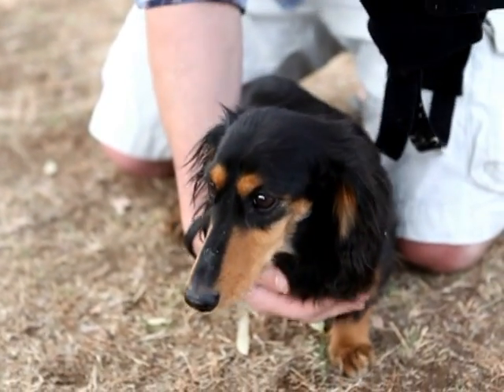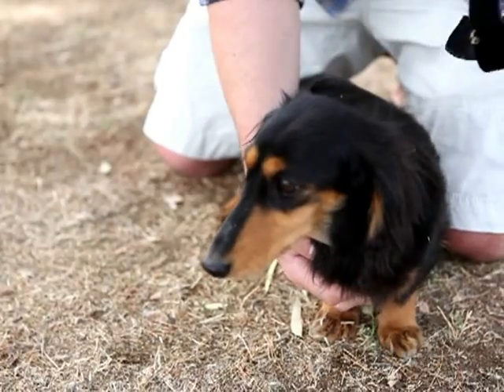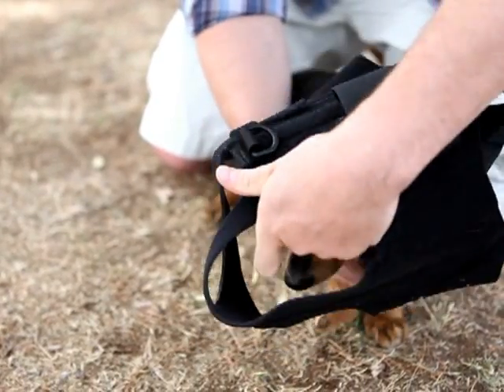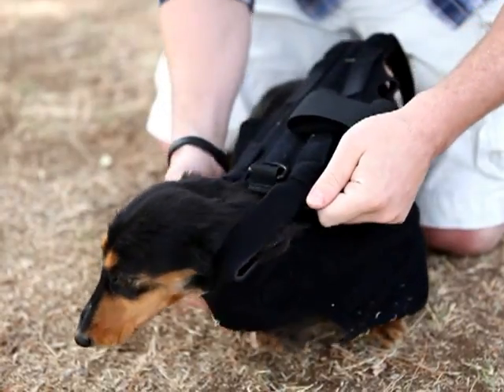This is the little back bracer that we're putting on Livy here. As you can see, I un-Velcroed the body part and all we do is just slip it over her head. Good girl.